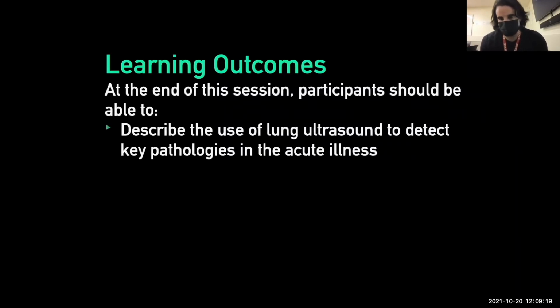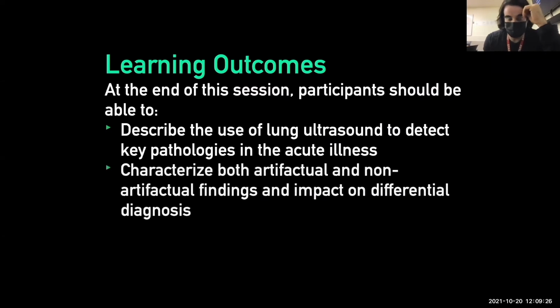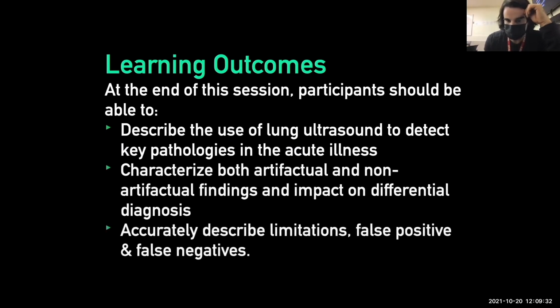But I hope that some of you can take from this that you can use lung ultrasound to really detect key pathologies in acute illness, and that there are both artifactual and non-artifactual findings that really do impact the differential, and talk about some limitations, false positives and false negatives.